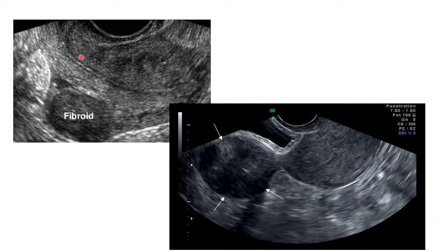So again, if you look here at the uterus, you can see nicely that we do have a fibroid. So this one again is a subserosal fibroid, because you can see it's indenting the serosa of the uterus. So this one is the endometrial lining. You can see it going all the way, connecting the cervix there to the rest of the uterus. So there we are. We have a subserosal fibroid around the isthmus of the uterus there.